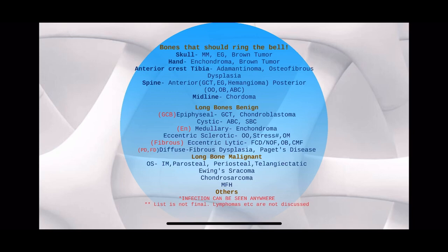If it's benign and there is no soft tissue extension: if it's epiphyseal, think GCB — GCT and chondroblastoma. If the lesion is cystic, meaning it's in the medullary canal and both cortices are touched, then it can be ABC or simple bone cyst. Medullary means enchondroma — only inside the medulla, no cortices touched. If it's eccentric and sclerotic, it's osteoid osteoma.